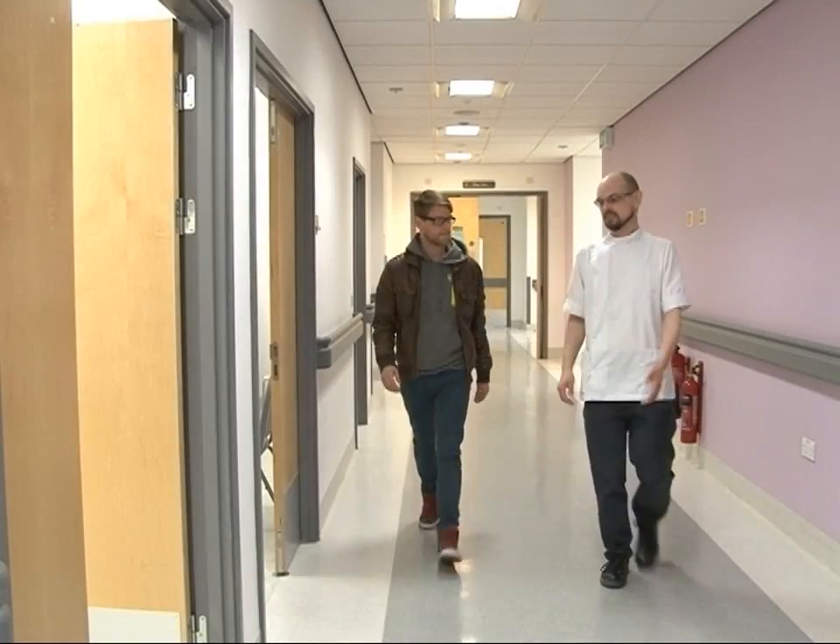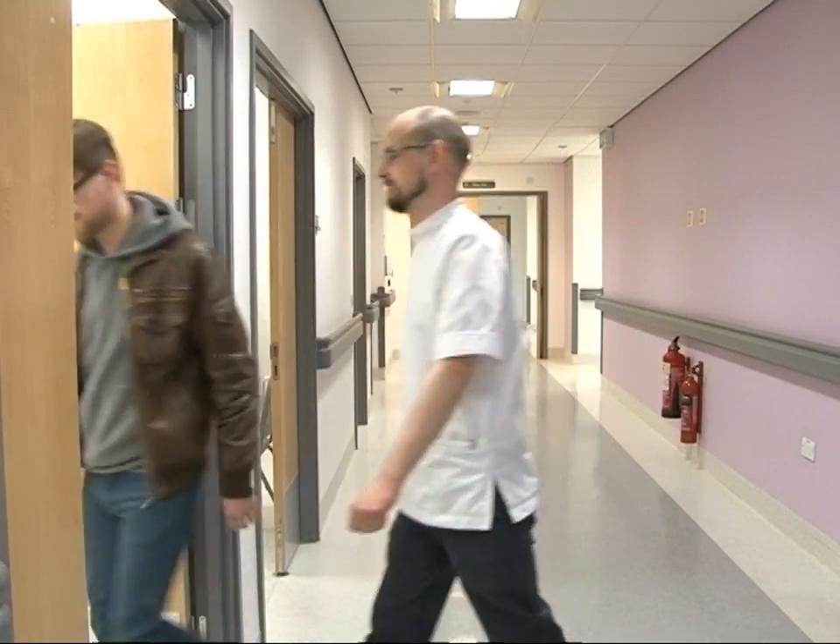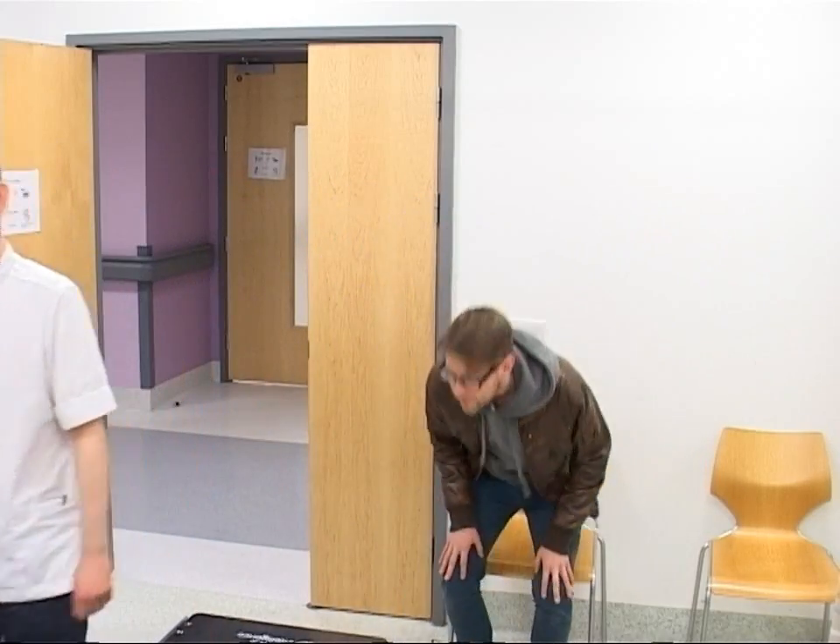There are several stages to planning your radiotherapy. At the beginning of each stage, we will explain what is going to happen next. Please feel free to ask us any questions you have about your treatment and care. It doesn't matter how often you ask — we want to make this experience as easy as possible for you.